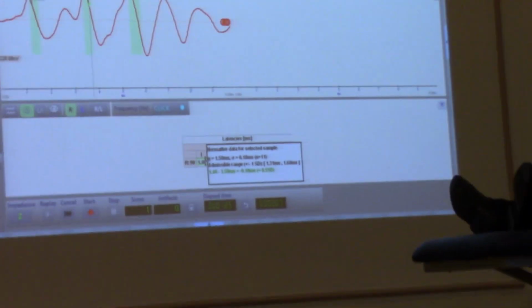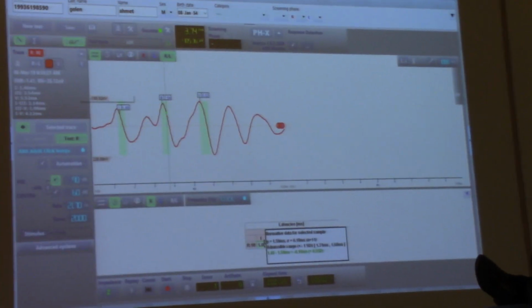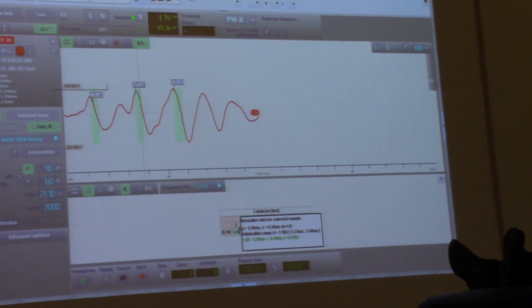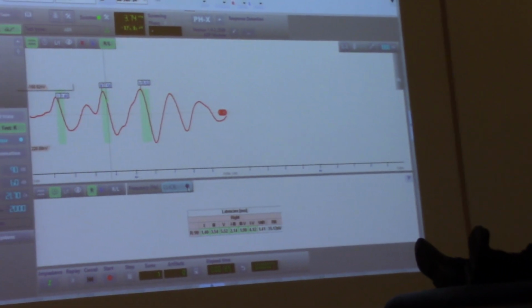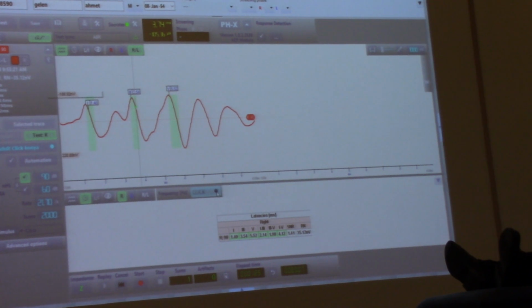Dalgayı işaretledikten sonra altta açılan grafikte üzerine geldiğinizde bunun bir özelliği olarak bahsediyor. Yani dalganın çıktığı minimum ve maksimum değer aralığında görebiliyorsunuz. Standart sapmasıyla birlikte veriyor. Also, we have two other important parameters: signal to noise ratio and residual noise. İki tane önemli diğer parametre sinyal gürültü oranı ve rezidüel gürültü.